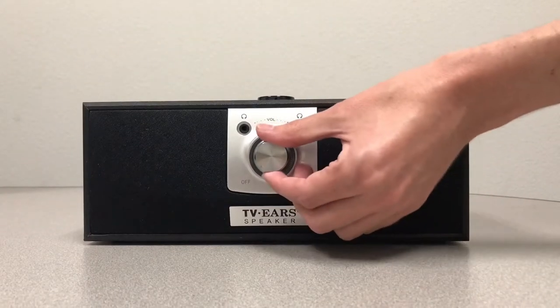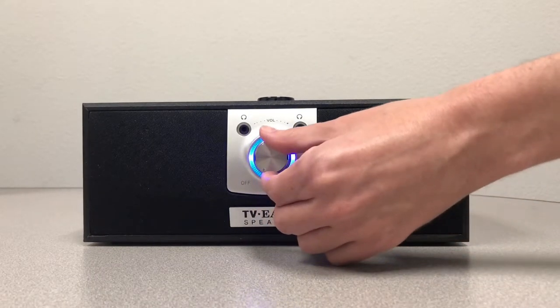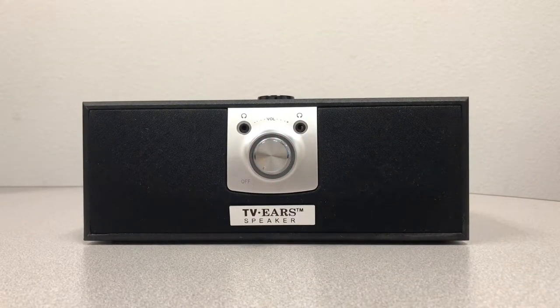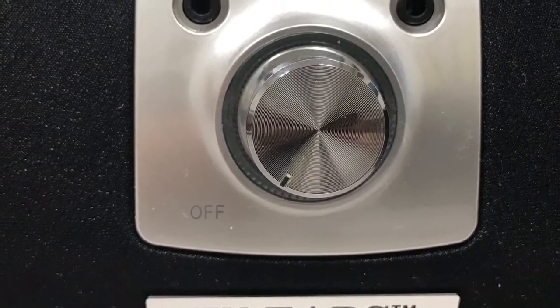Turn the volume dial on the front of the speaker clockwise. When the blue light glows, the speaker is turned on. Turn the knob all the way counterclockwise to turn it off. The knob not only turns the speaker on and off, but it also controls the volume. To hear the television through the TVEUR speaker, proceed with installing the transmitter.